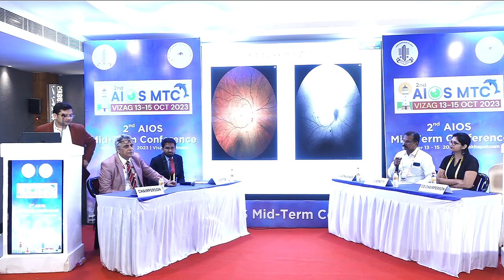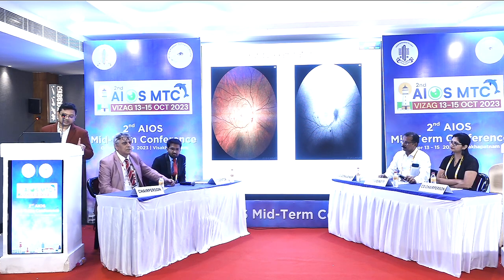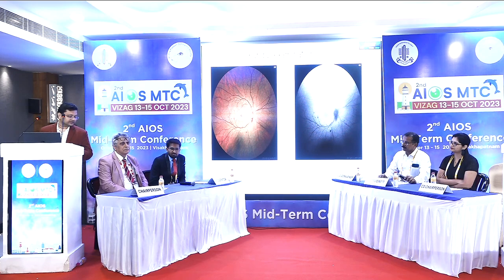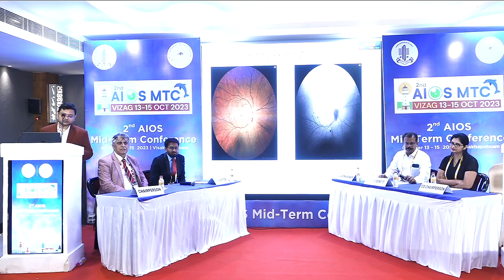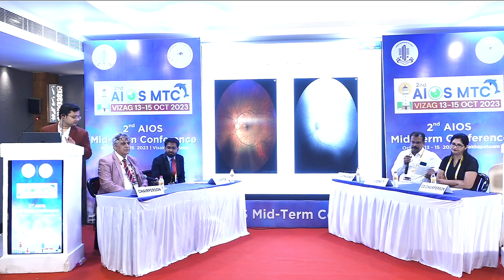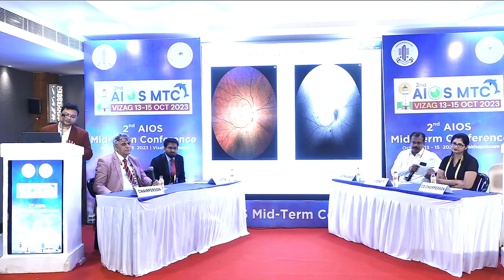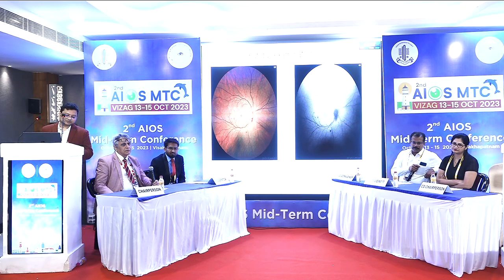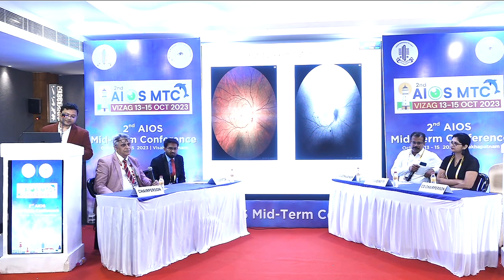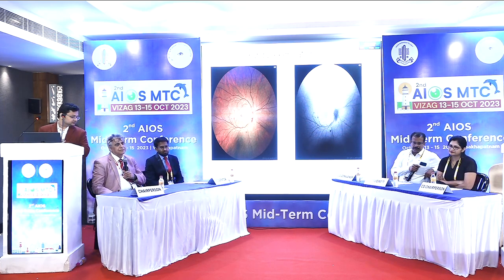This is a 56-year-old male, sir, who came with diminution of vision for the last 1 day. He has a blood pressure of 188/99, and there is tortuosity present when we compare to the other eye picture. The veins are tortuous, and a few hemorrhages are present around the blood vessels, and there is a splinter hemorrhage below the disc. And there is whitening of the retina, and the area of the arterial component is very evident. Yes, sir.